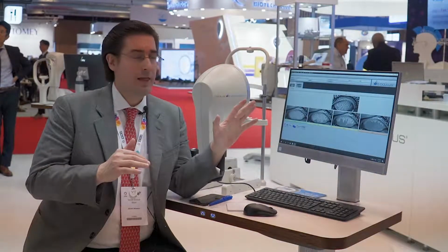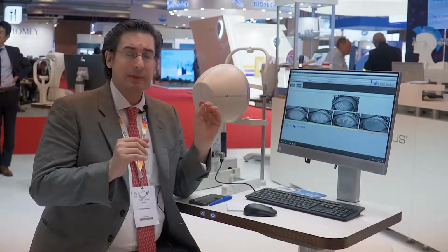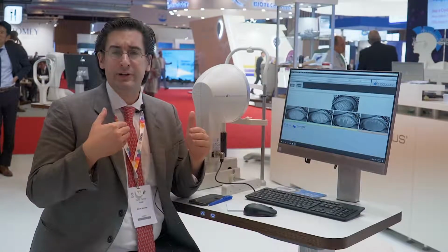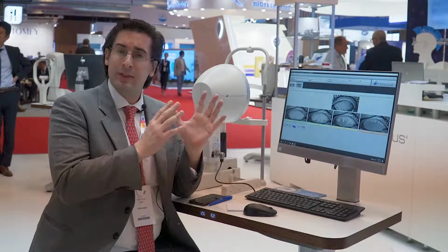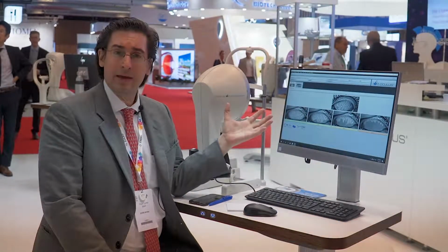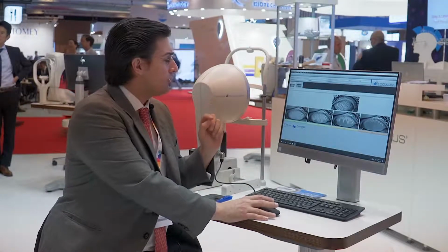And how can this help me? Dry eye is a very interesting disease. Why? Sometimes symptoms and signs are not very well connected. And patients can refer some kind of strange symptoms, but it's not clear to them that that's caused by dry eye. And these kinds of exams can make it very, very graphic. So I can take it and show to the patients. So I'm going to show you some examples.